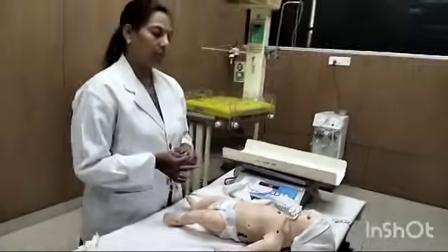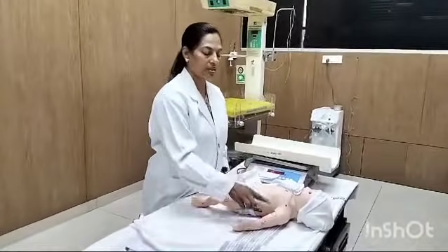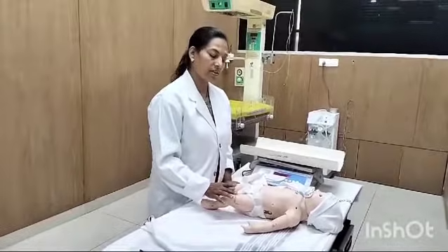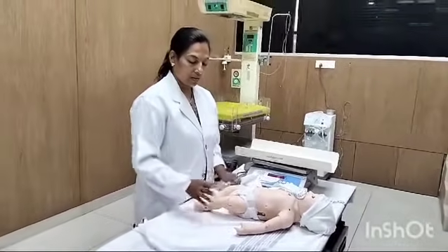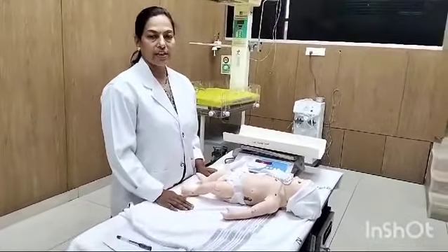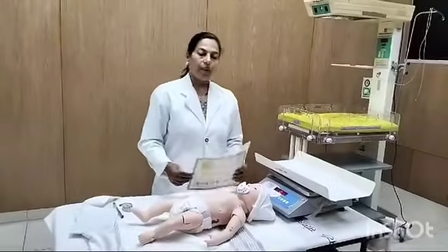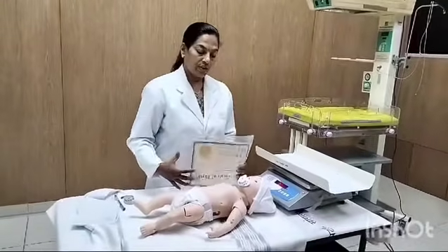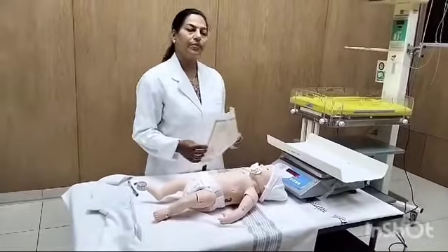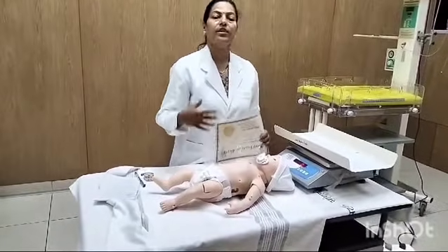Now, we have already seen head circumference, chest circumference, mid-arm circumference, abdominal circumference, and mid-thigh circumference. Now we will check the height of the baby.